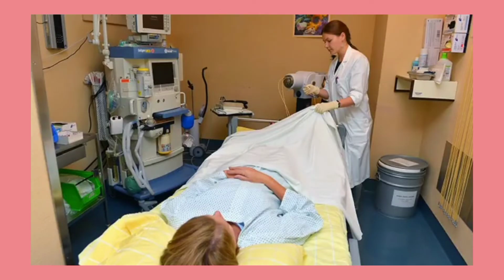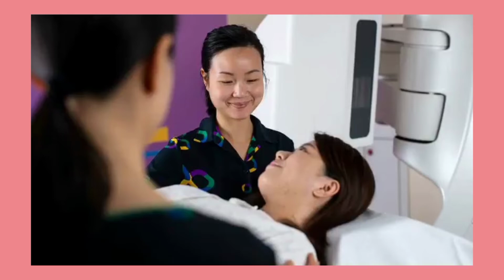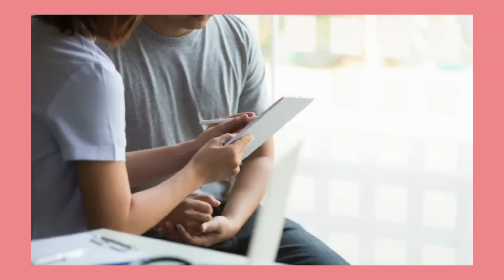For recovery, most people undergoing HDR brachytherapy can return home after treatment. Once the radioactive material is removed from your body, you won't give off radiation or be dangerous to other people. In most cases, you can return to normal activities right away. You may experience some tenderness and swelling in the treatment area, temporary tiredness if you require sedation, or other side effects depending on your treatment site. HDR brachytherapy typically causes fewer side effects than conventional radiation.